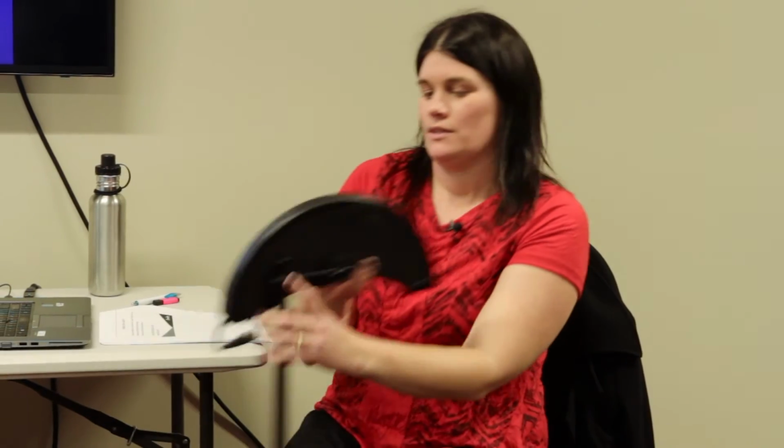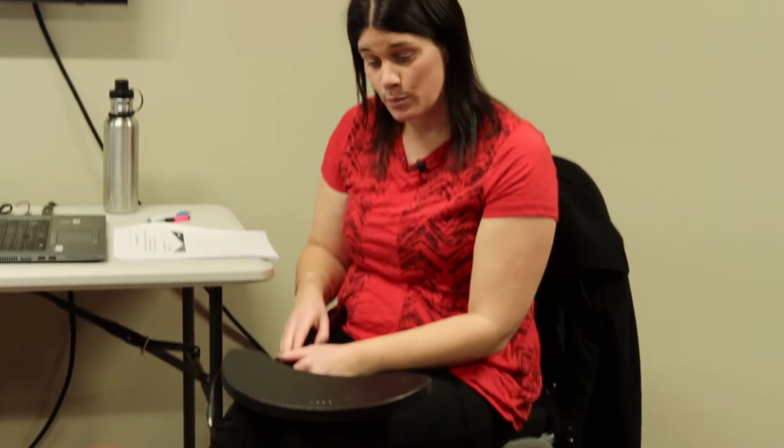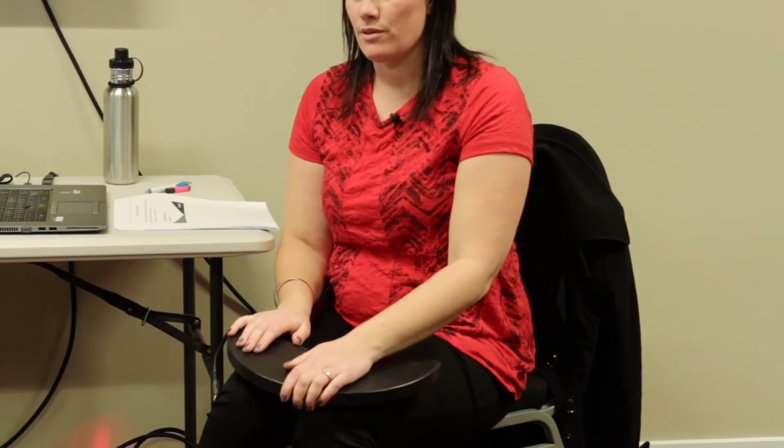And again, how you mount these is limited by your imagination and what the suppliers can pull off. Fibre optic is, I'm not sure you can see these 4 things. Basically you have fibre optic beams come up. This is one example that it's set up with a tray. You can buy the units on their own.